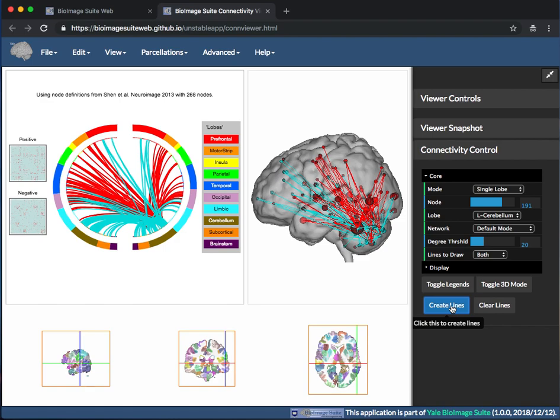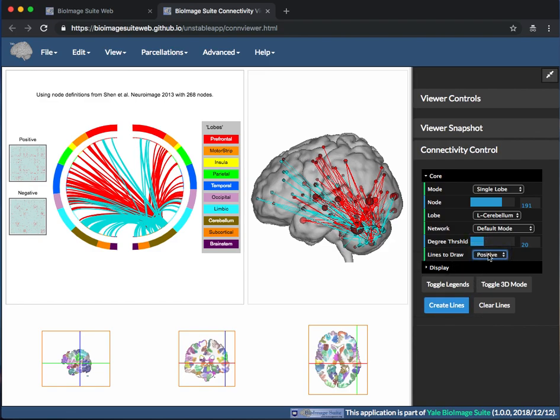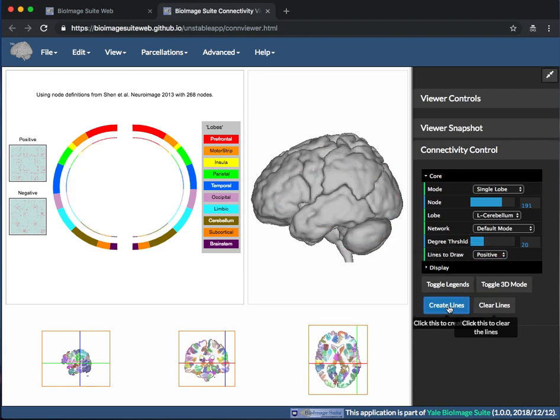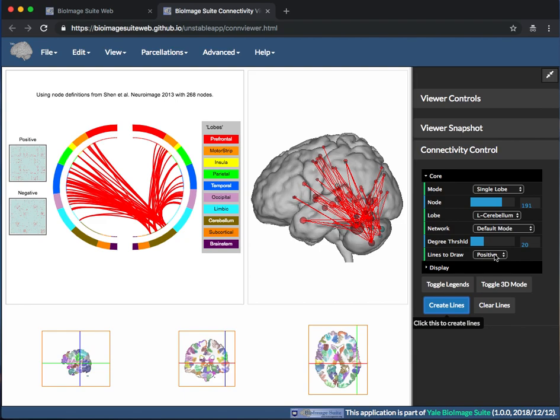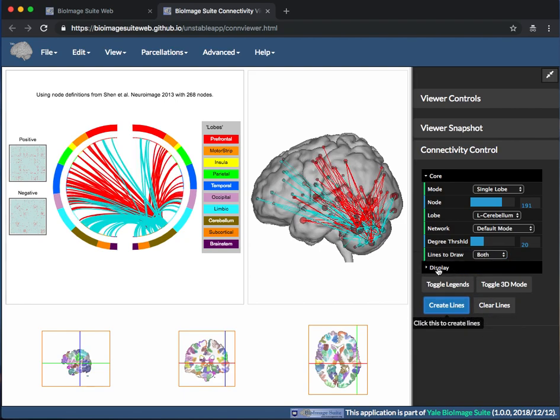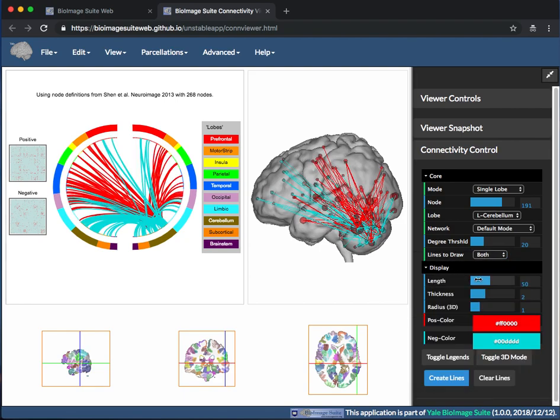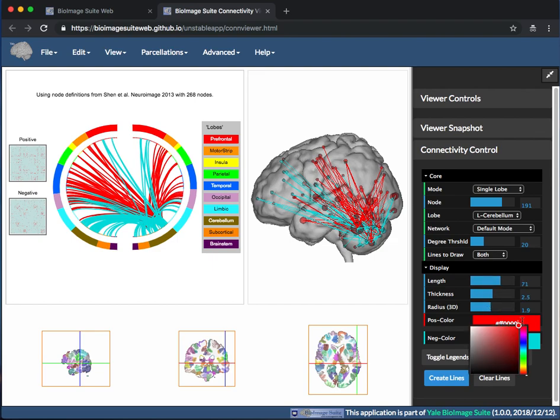Under the Lines to Draw section, you can select whether to show only positive connections, only negative connections, or both. Under the Display section, you can alter elements of the display, such as the length, thickness, and colors of lines.